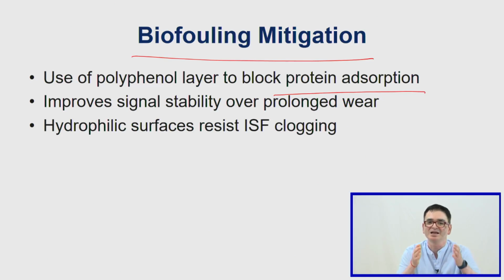When you have membranes, the membrane has got pores, and those pores, I think we already heard this from Khalid yesterday, have got pores through which small molecules like glucose and lactate can diffuse through. But albumin, which is a larger protein molecule, which has got about 100 kDa, none of those larger protein molecules can actually go through those particular pores. So it's very important to have this, and that's how you can prevent the biofouling effects. Having said all of that, you still will have some biofouling effects. You cannot completely eradicate any biofouling effects, because the body will keep on sending different forms of proteins around it. Okay.